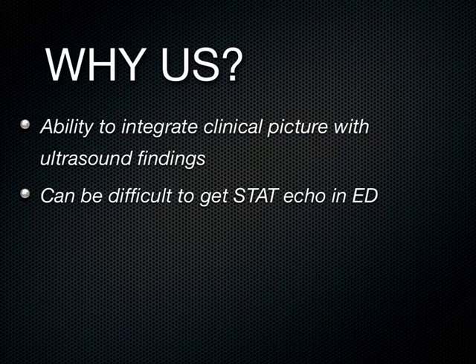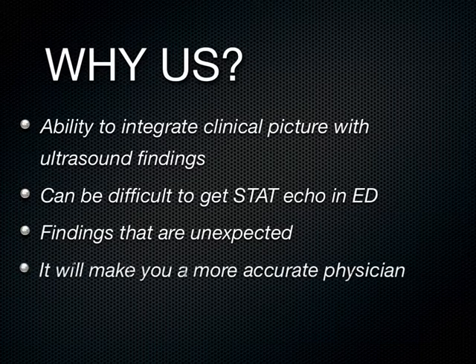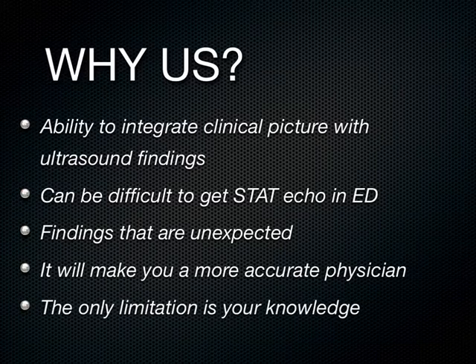We know sometimes it's difficult to get cardiology to come down and do a stat echo depending on the time of day. And by stat, maybe it gets done in 15 minutes, maybe 20 minutes. I don't know. Stat for me means in the next 60 seconds. Also, in that patient, it was an unexpected finding. And I think all that makes you a more accurate physician, the only limitation being your knowledge.